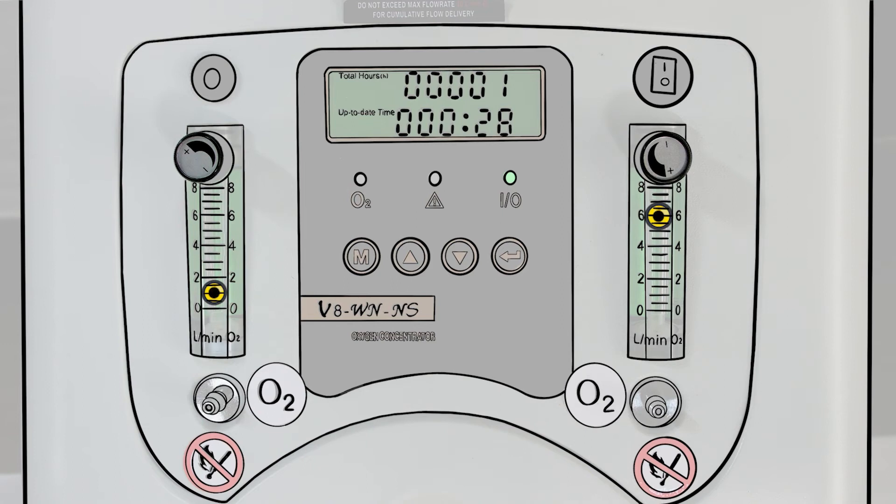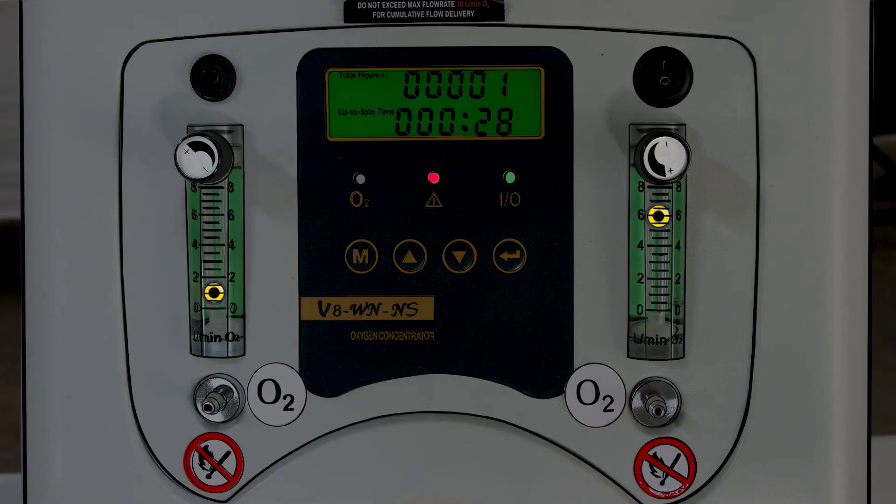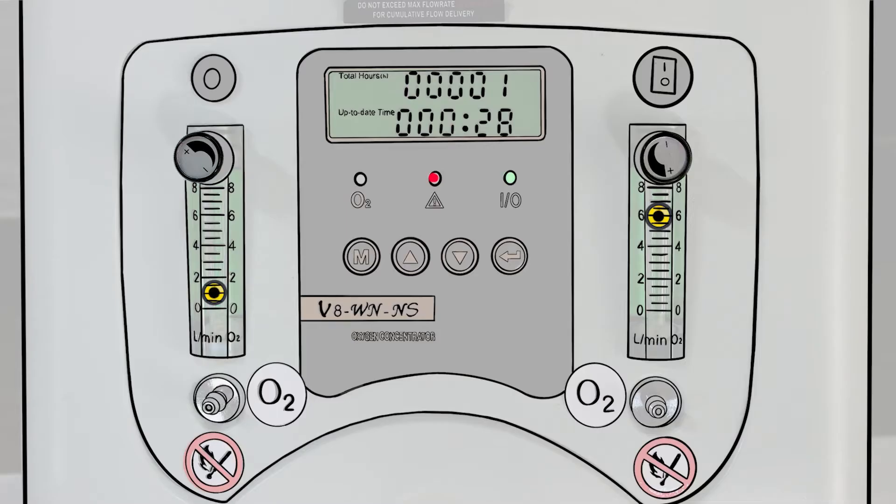The final alarm in the middle is a general malfunction alarm, which alerts you to other problems in the machine. If this lights up, you need to call the maintenance department to investigate what is wrong. The machine has a system to monitor itself and look for problems. If the general malfunction alarm goes off, it means it has found something wrong internally, which needs proper maintenance.